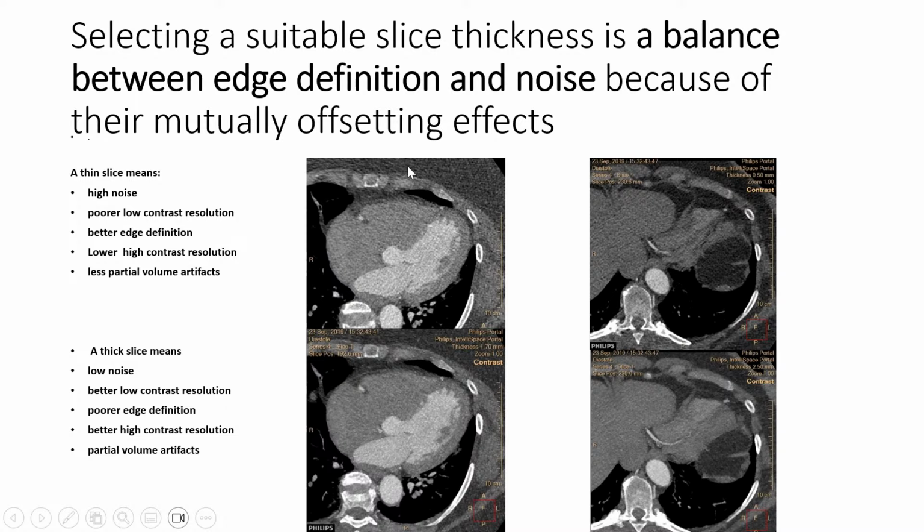This is very important. Some people think 64 slices compared to 16 use less radiation, but that's not the case. Same thing when we do ultra high resolution mode with photon counting CT, the dosage is not lower. So that's important to understand.